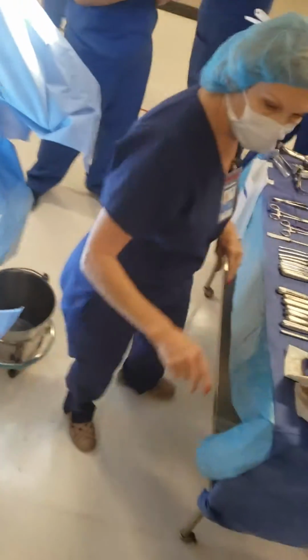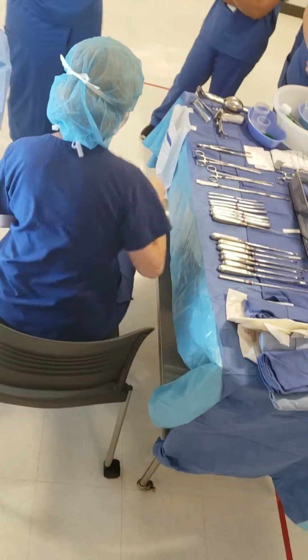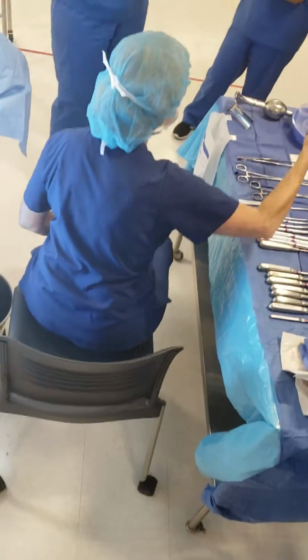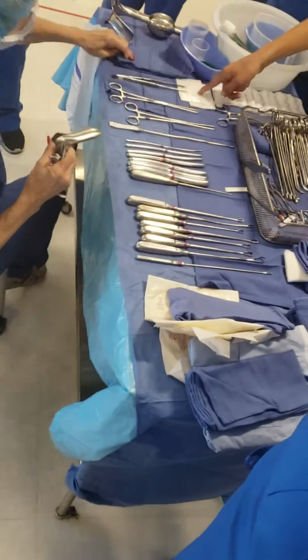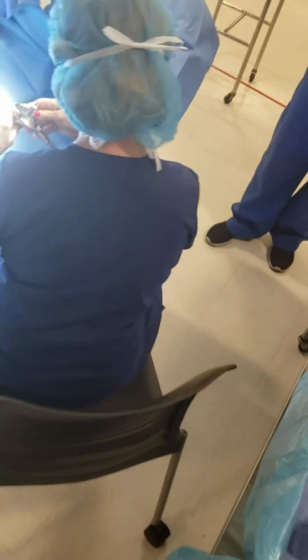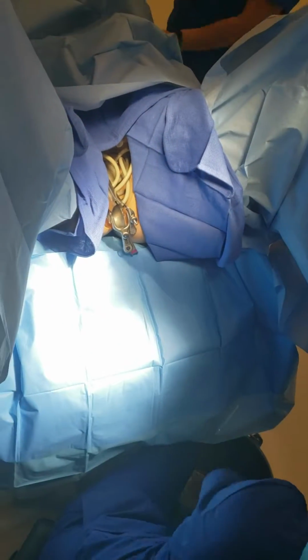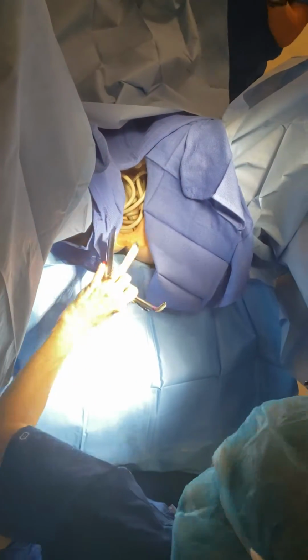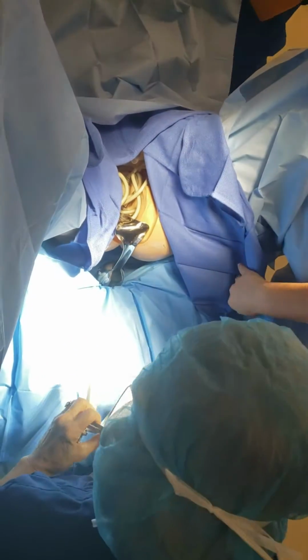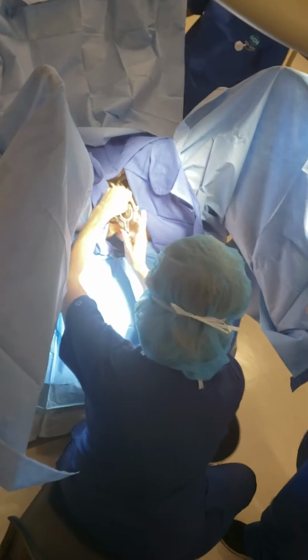Okay, so first thing they're gonna do, they're gonna scoop this up for the doctor. Say the goop is here. You were asking about this, so they dip that in there, and it just hangs down. Now, this is not here normally, it just hangs down, and it helps for retraction and for exposure. Do both of those things stay in there? No, just one of them, it's either one or the other.